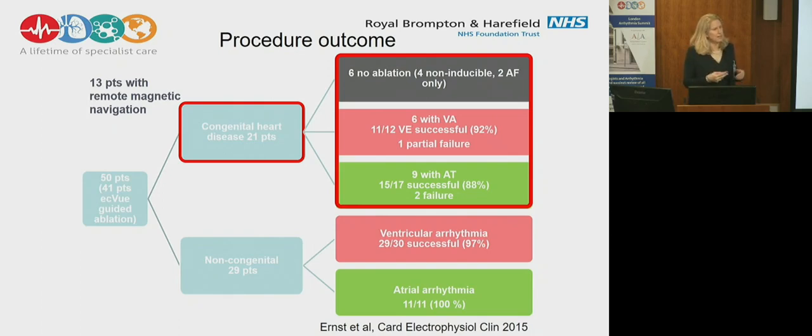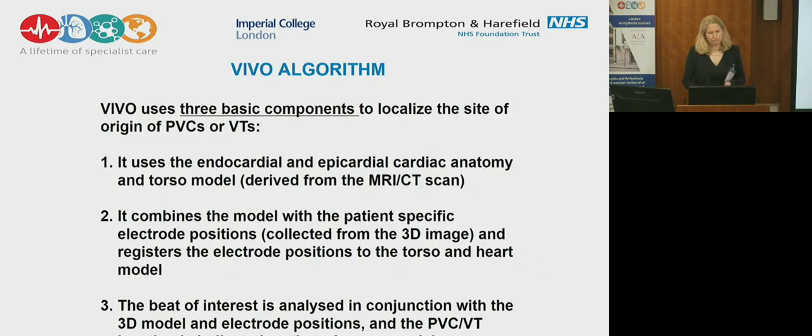Now, we tried the other ones, we burst paced them, and we did not get anything meaningful out of them, besides 2 patients where we induced atrial fibrillation only, and again in a congenital setting that is very, very difficult in advance, and I did not proceed in these patients to do AF ablations. So it actually helps quite well to identify patients that you can actually treat.